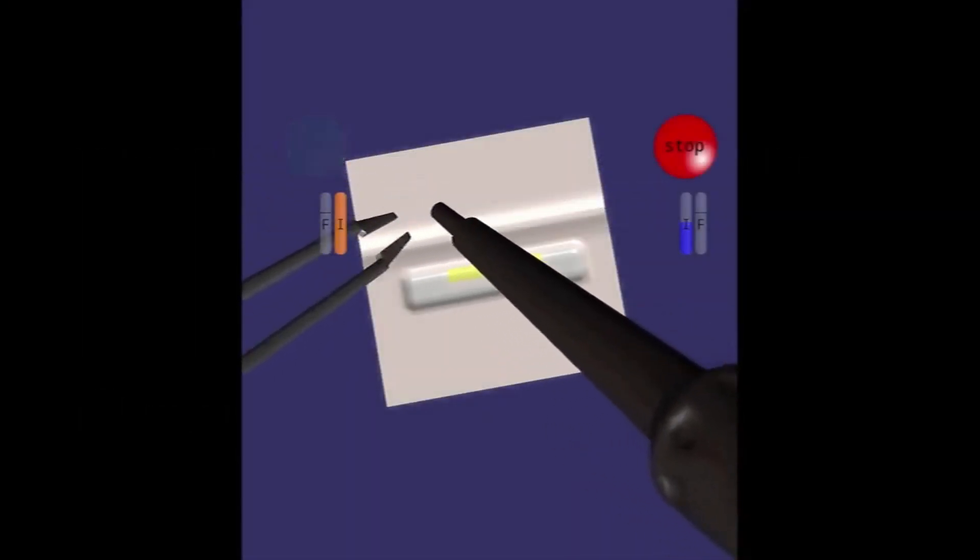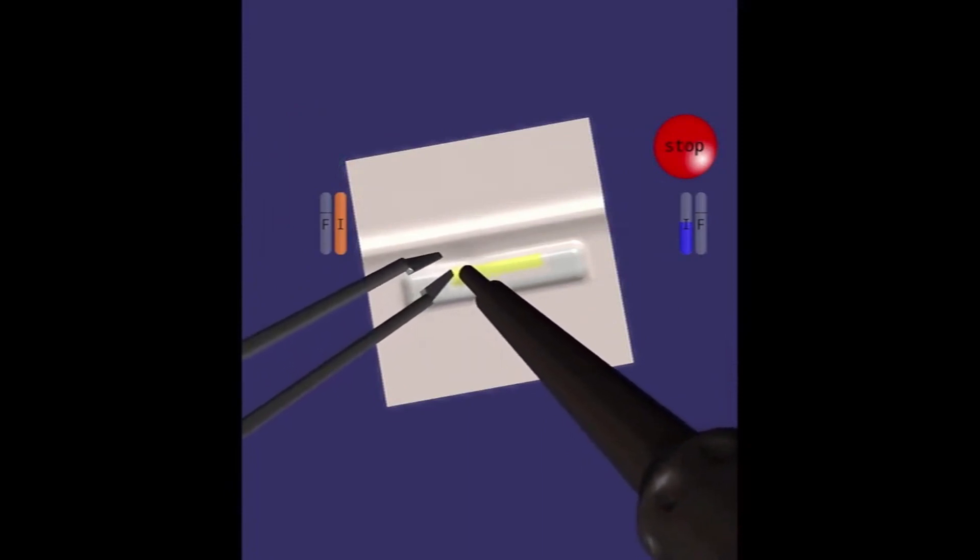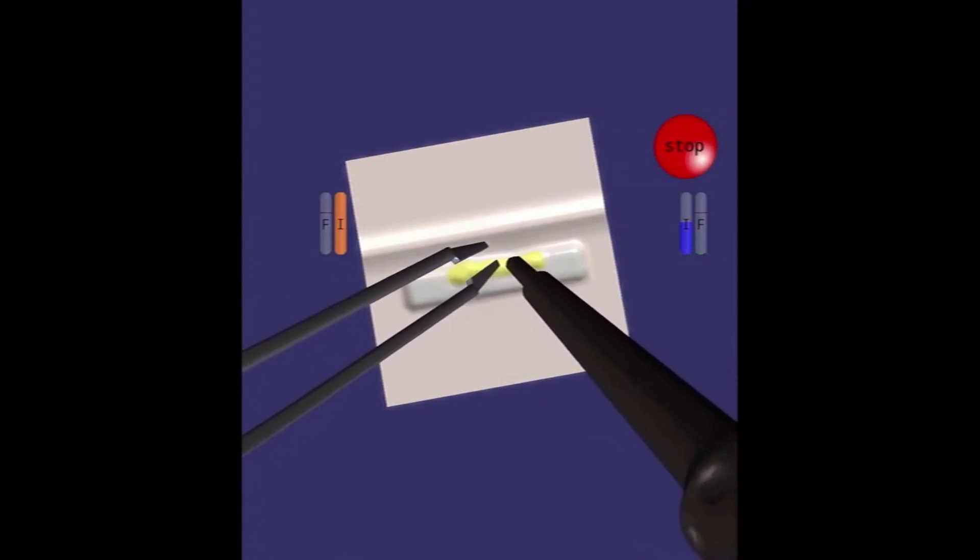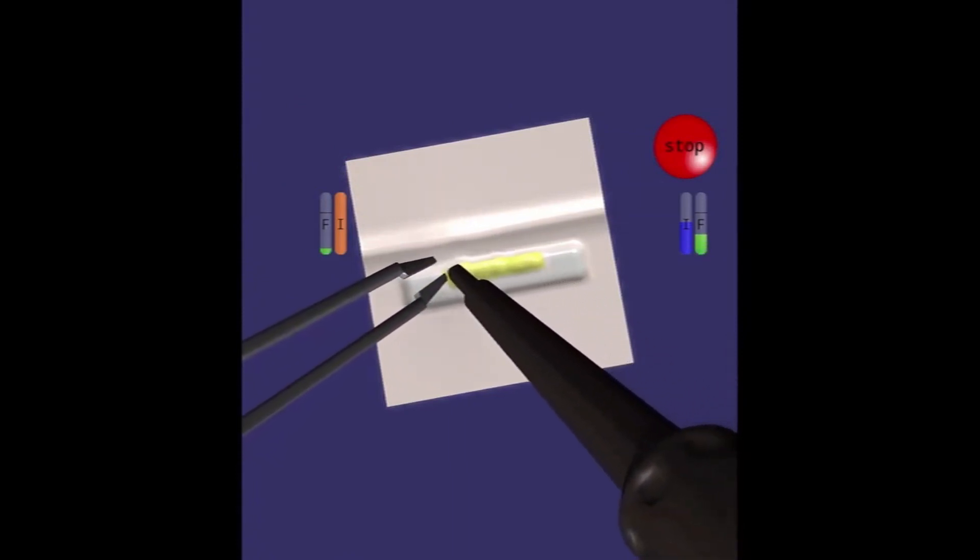In the practice scenario, participants' objective is to resect the yellow tumorous lesion with minimal bleeding and damage to the surrounding healthy tissues within 5 minutes.